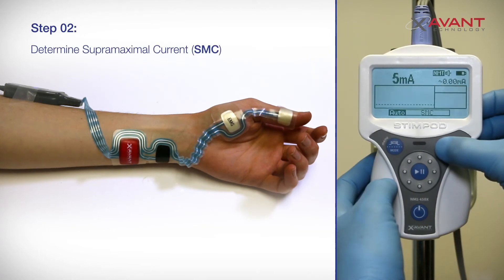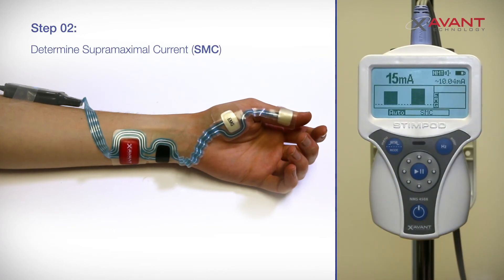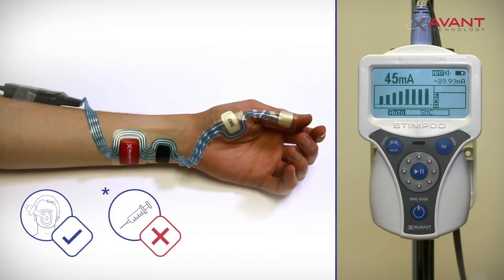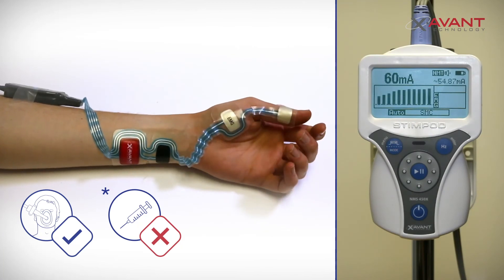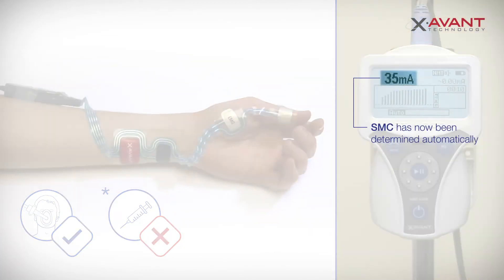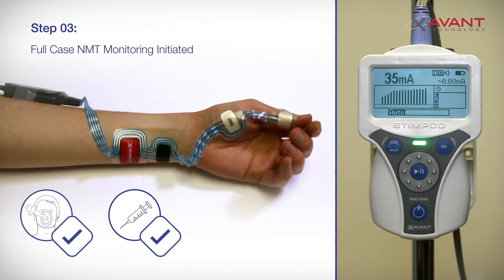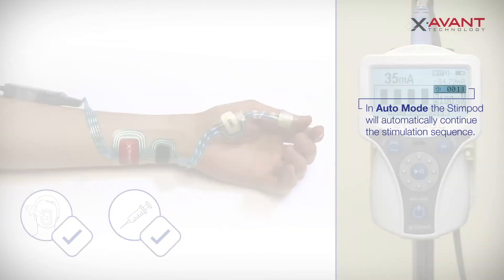Press the enter key to initiate the supermaximal current. It is very important to make sure that your patient is anesthetized at this point but not relaxed yet. The StimPod will now confirm your electrode placement and determine the optimal current for your setup. At the end of the sequence, the current will be set at the determined supermaximal current. Full case monitoring has now been initiated and the StimPod will continuously and autonomously monitor your patient's depth of block, guiding your patient through to a safe extubation.